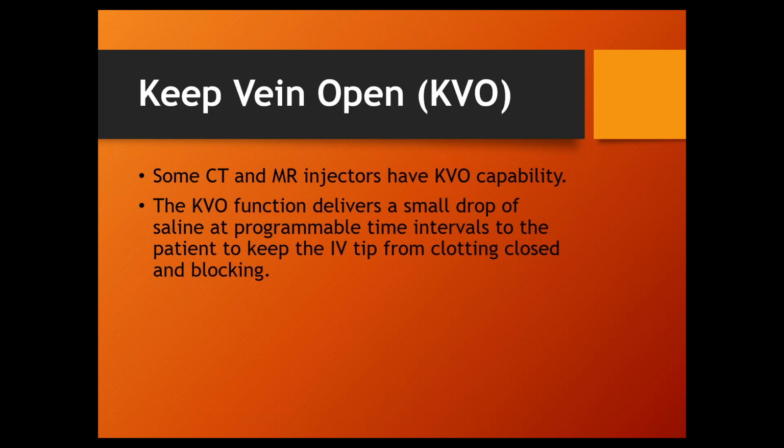That's a very old model. I don't think anybody does that anymore. That was an Envision. Yeah, that's the KVO function. IV needle or infusion pumps have that KVO feature to them. Some contrast injectors do as well.